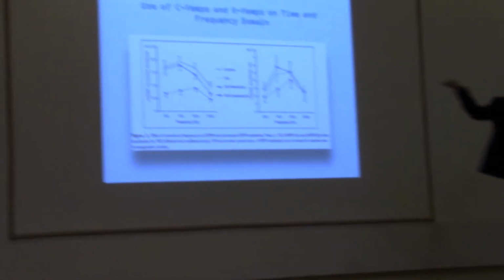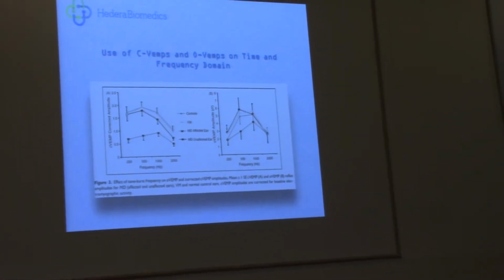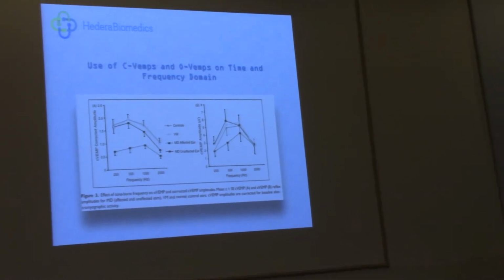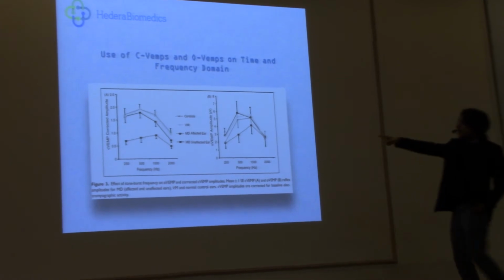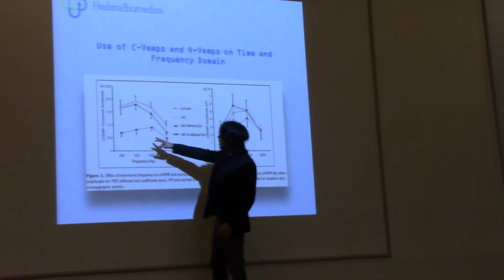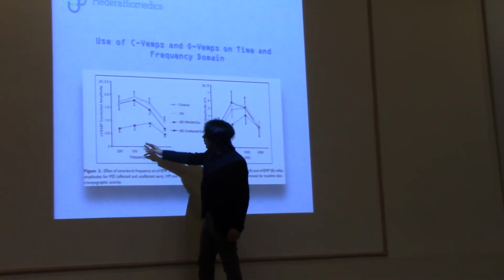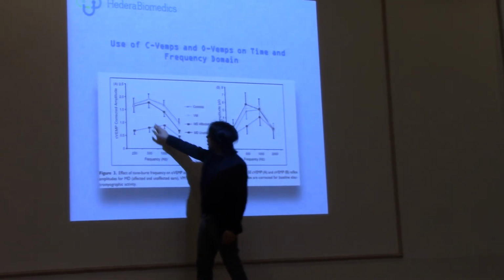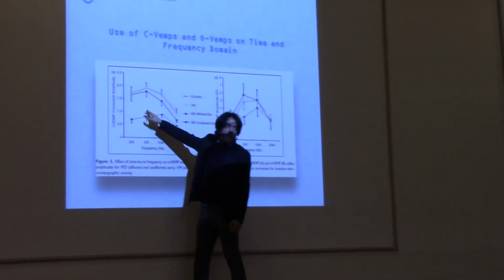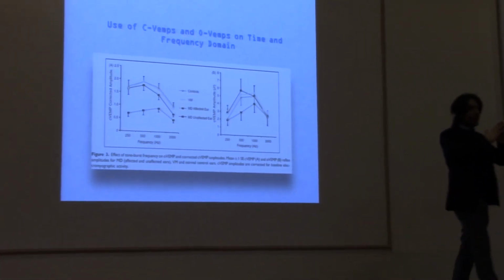Here is a very interesting extract from a paper that I mentioned before, where you can see many examples of the tuning curve approach on VEMPs. Here you have a tuning shift in a Meniere disease affected ear. You see the maximum complex peak is at 1000 Hz of stimulation, while here is the unaffected, normal ear, with a tuning at 500, as I said.